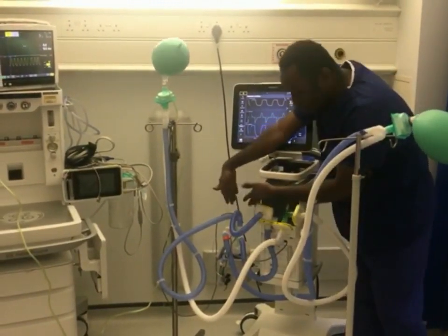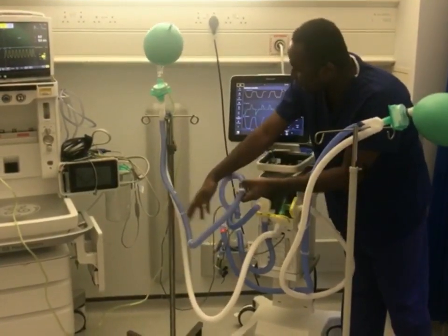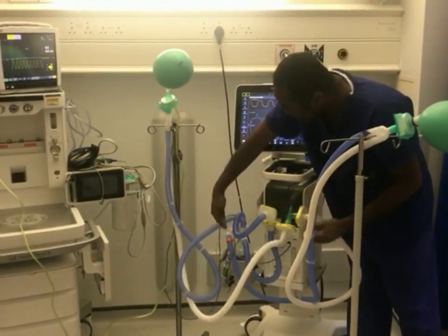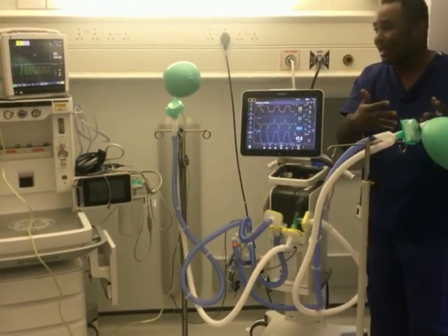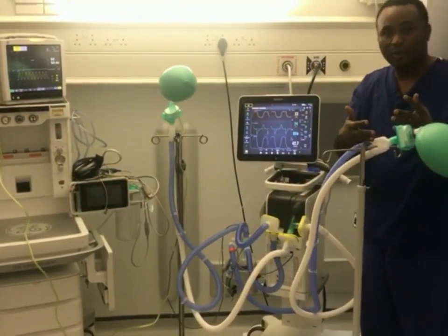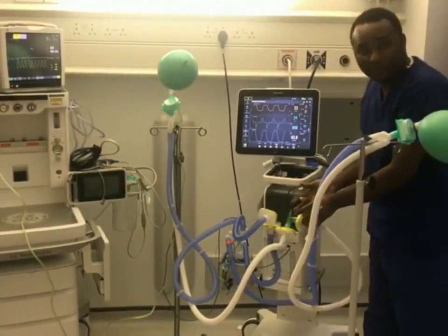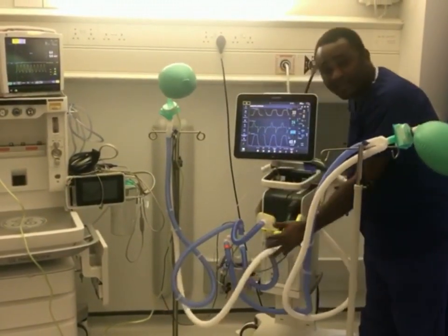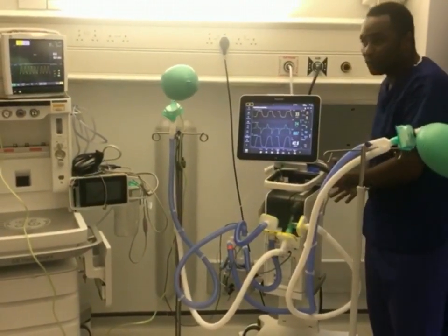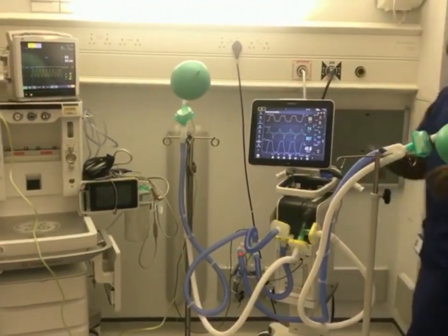The gas goes into the humidifier and then comes out through this inspiratory lane to this patient, and then comes through this again from the chamber, and then comes to this patient as well. When this patient expires, it goes through the expiratory lane and then goes out. This patient expires, it comes through this expiratory lane, and then it goes out. So I'm just going to hand you over to my colleague Harvey to explain the rest.